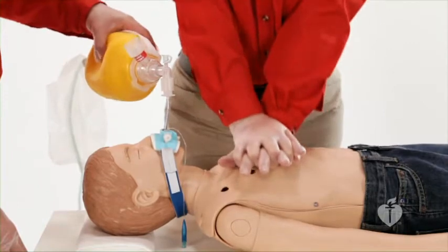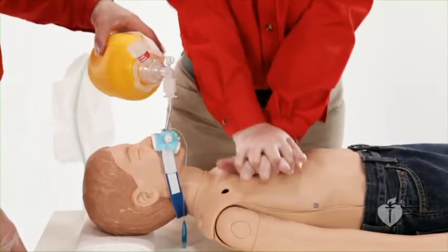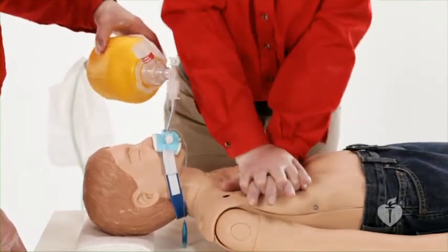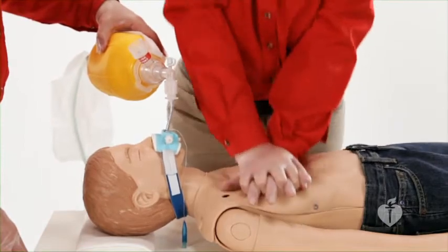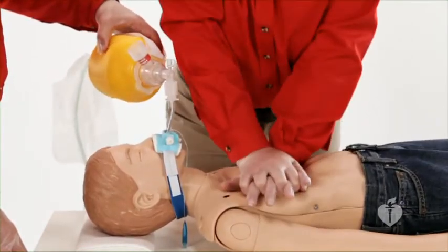One rescuer delivers continuous chest compressions at a rate of at least 100 per minute. The second rescuer gives one breath every 6 to 8 seconds, about 8 to 10 breaths per minute. The rescuer giving ventilation should be careful to avoid excessive ventilation.